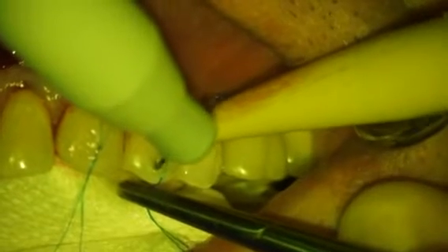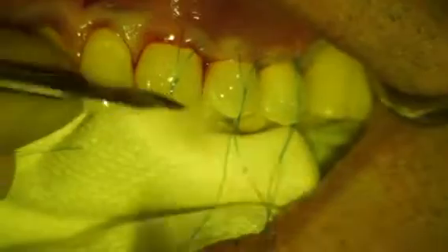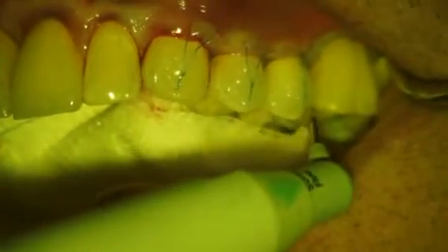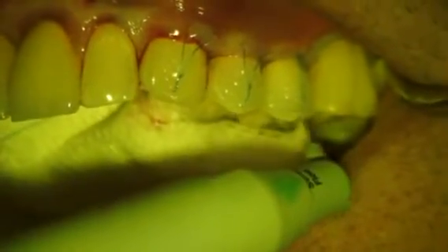The polypropylene sutures are then secured to the facial aspect of each tooth by placing a small amount of flowable, light-cured composite over each suture knot, preventing apical migration of the gingival margin during early stages of healing. The extended suture ends are removed with a scalpel, and a small amount of additional composite is placed over the sharp edges of the suture knot. The bonded sutures can be removed after 3 weeks, or at the discretion of the clinician. Over time, the gingival margin will reposition itself at the level of the CEJ.